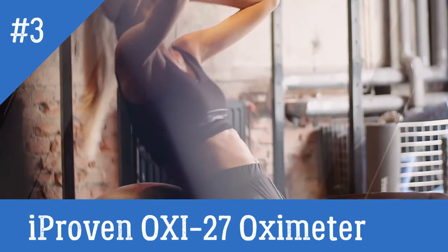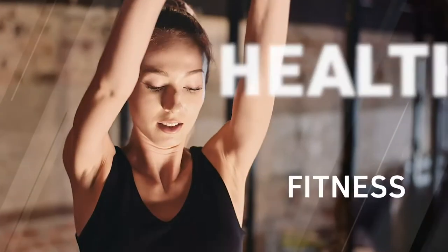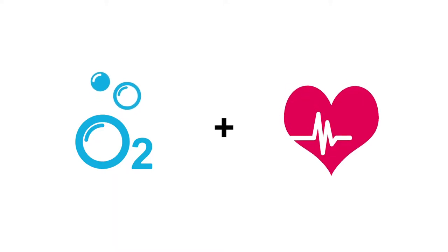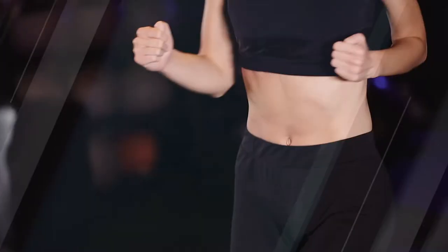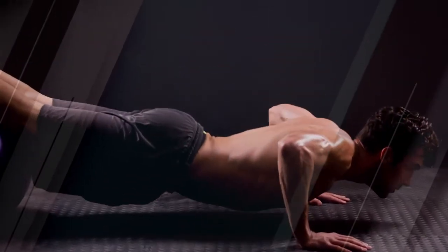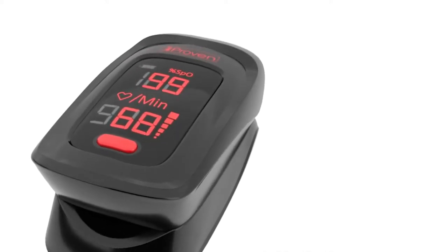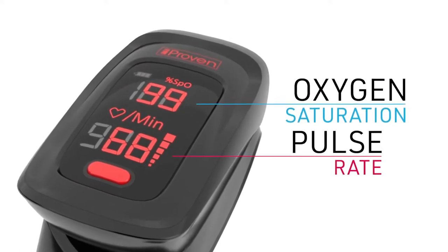The fingertip pulse oximeter offers a great way to gain insight into your health and fitness. By showing the level of oxygen in your blood and pulse rate, it will be much easier to focus on your specific health goal and reach a healthy lifestyle. This video will explain how to use the oximeter for the most accurate results. The oximeter is a digital device intended to non-invasively monitor the oxygen saturation and pulse rate at home.